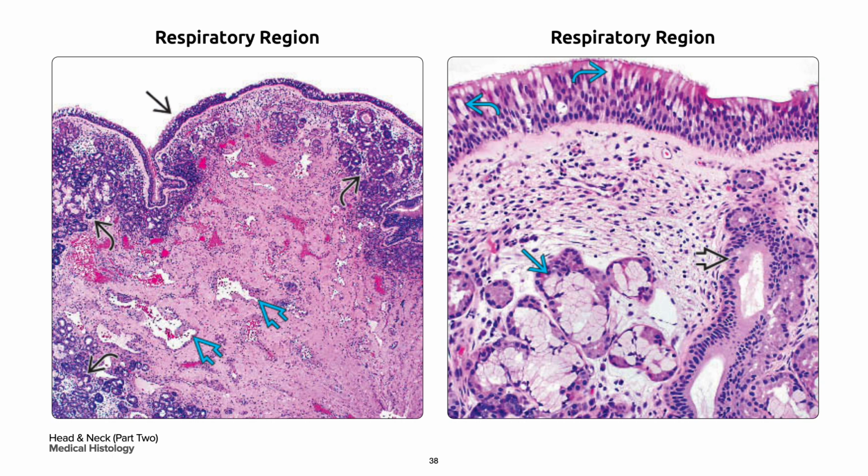On your right are your mucous glands in a single blue arrow, which drain to the surface via small excretory ducts in a bold black arrow. Your Schneiderian epithelium is pseudostratified and columnar. It contains cilia and scattered mucous or goblet cells in a curved blue arrow.